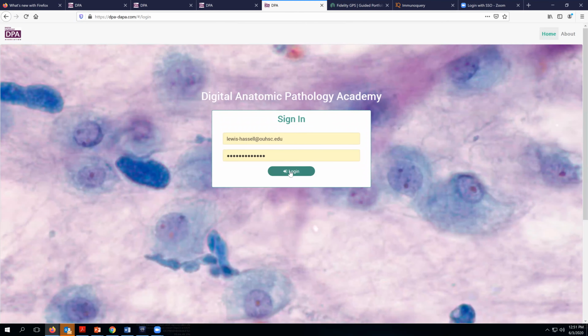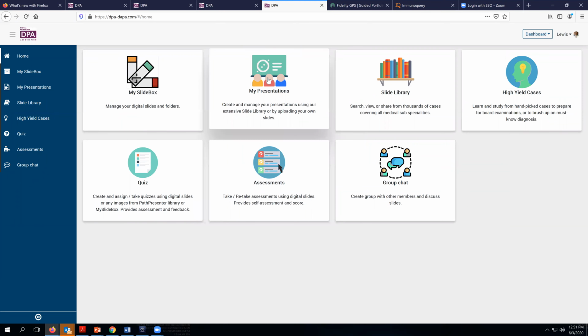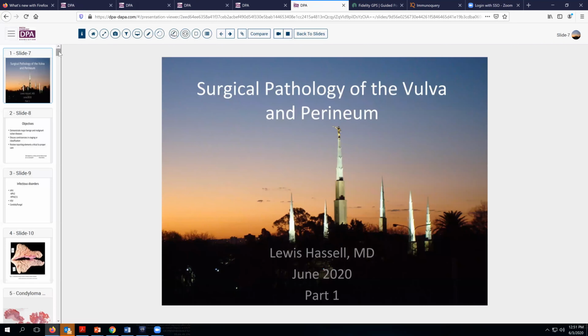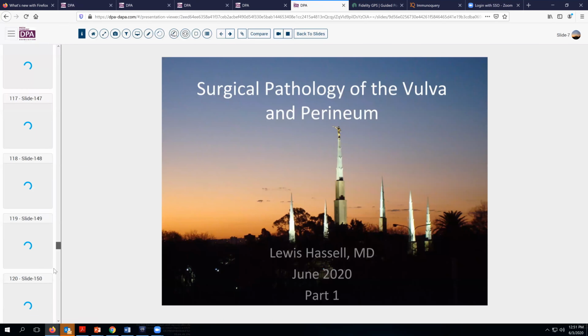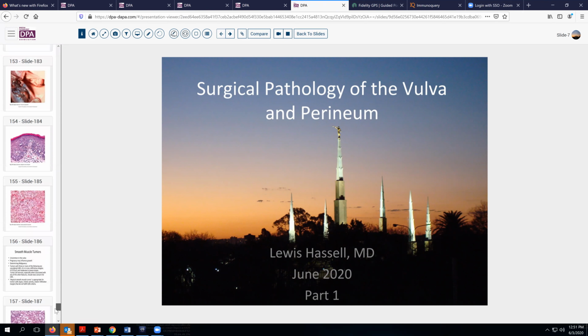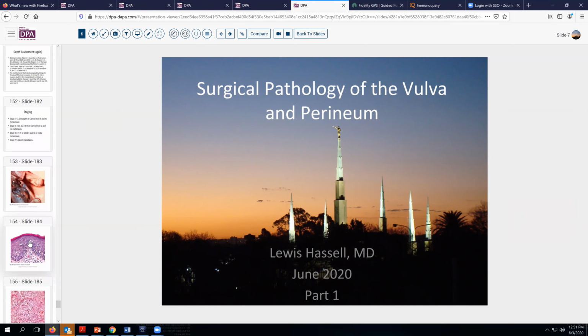Question? Girl emailed you the groups for part 3. Okay, so someone had a question. I'm not sure why I'm getting logged out here all the time. All right, so we'll go down here a little further. We're just about to the end.